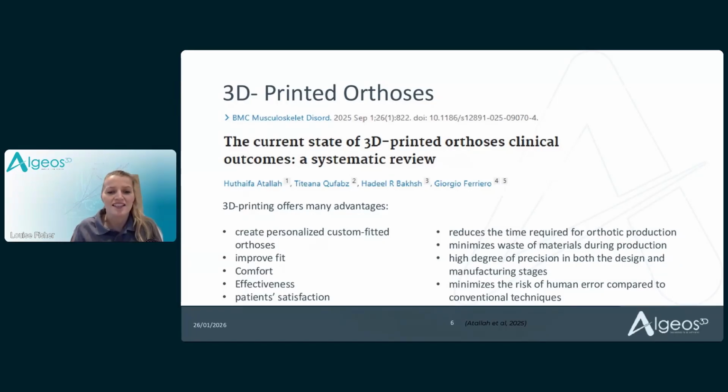So that is a really nice paper to read and explore, but I've obviously just given you an overview of the current landscape of the benefits of transitioning into 3D printed foot orthosis in your clinical practice.